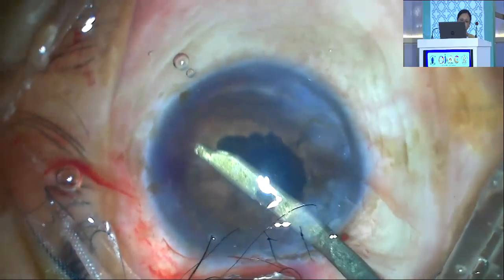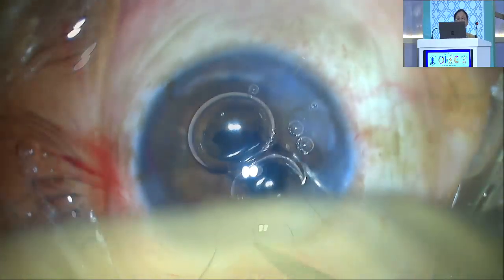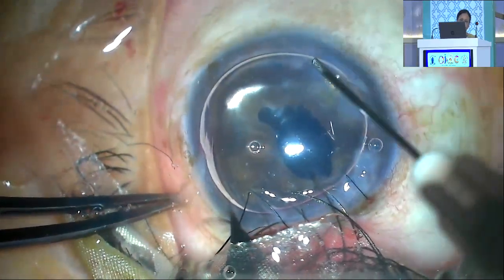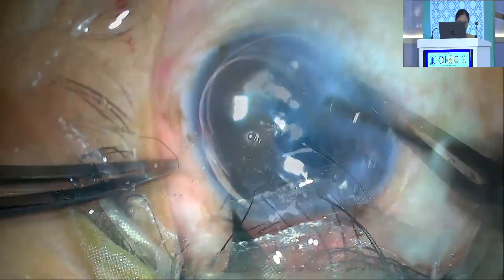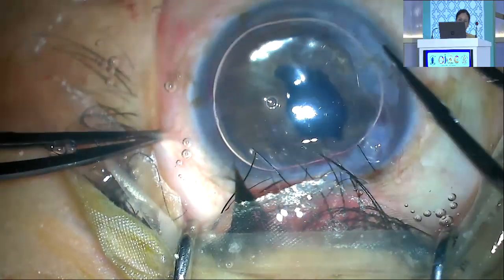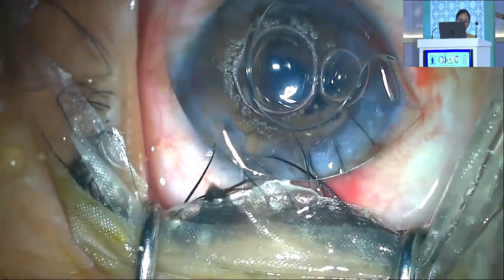Viscoelastic was removed and sutures were buried. An air bubble was injected into the AC. Localized anterior stromal puncture was done over the bulla. The hypertrophied epithelium was removed there, and a BCL was applied over the cornea to remain for 1 month.